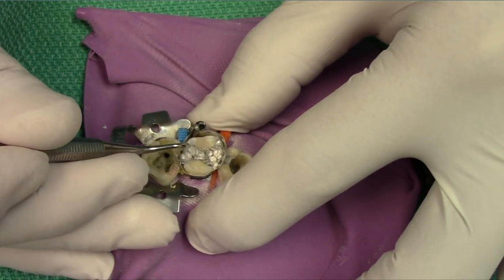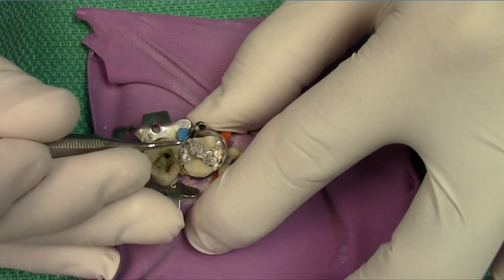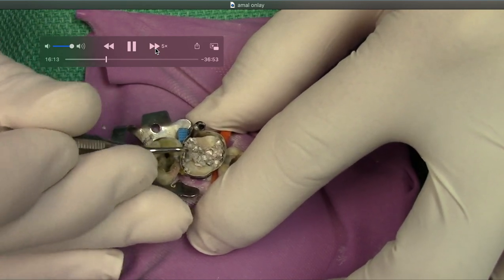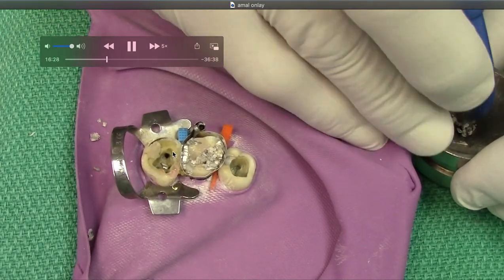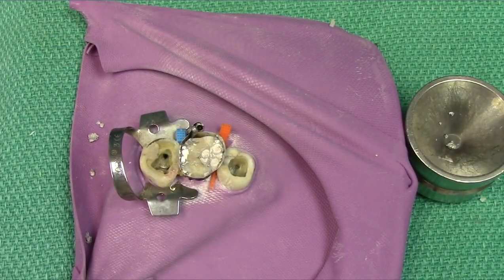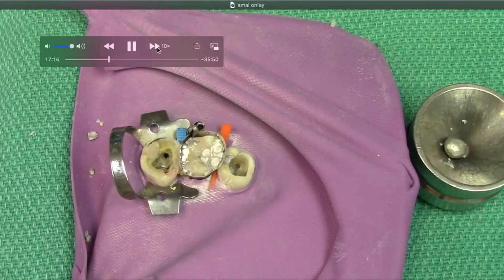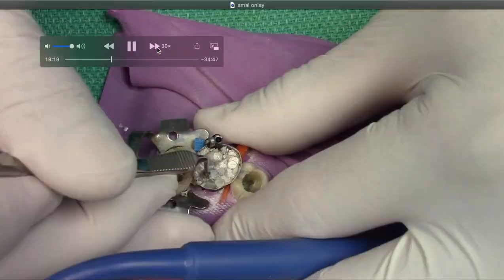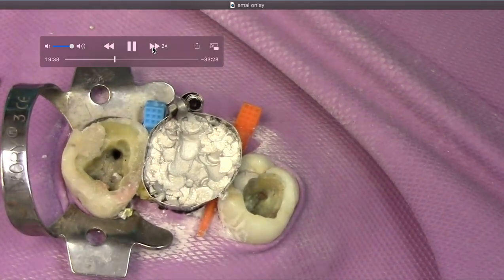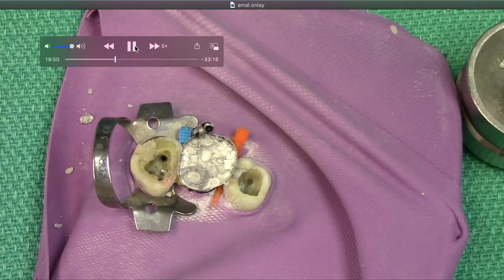I'm packing in the amalgam just like we normally do. Let's speed this up because it's pretty simple. While I'm packing, I'm keeping track of where the margins of my adjacent teeth are. Magically we've gone through about five capsules of amalgam, and now let's start carving. Actually, we're going to add some more first.